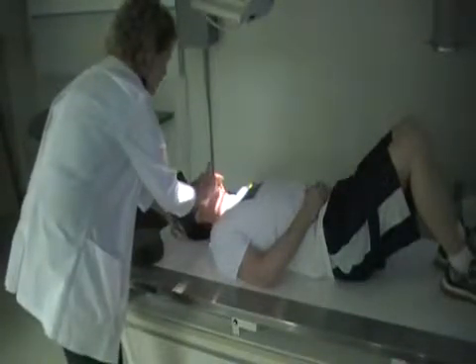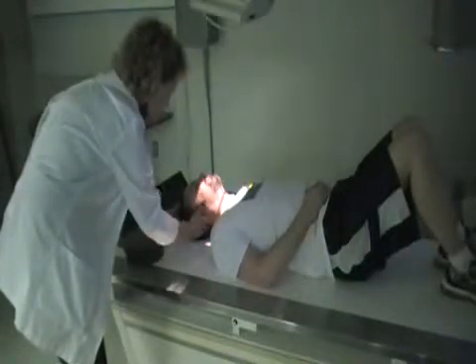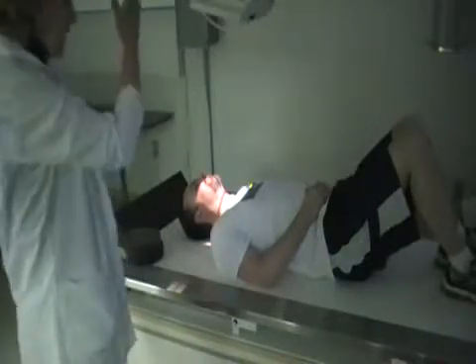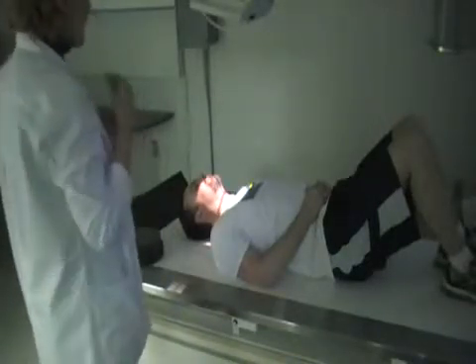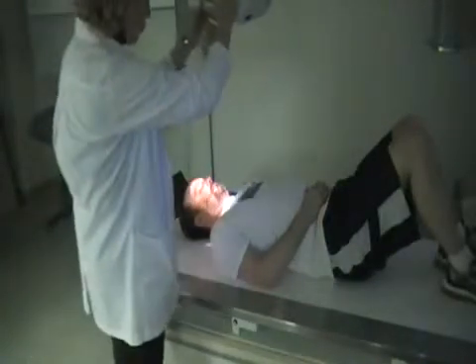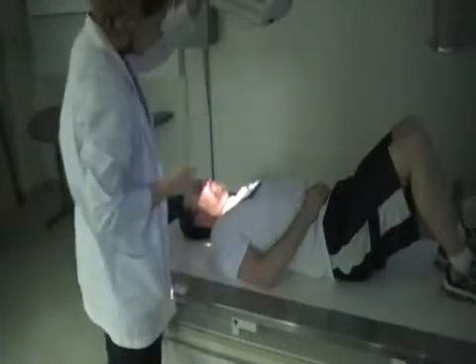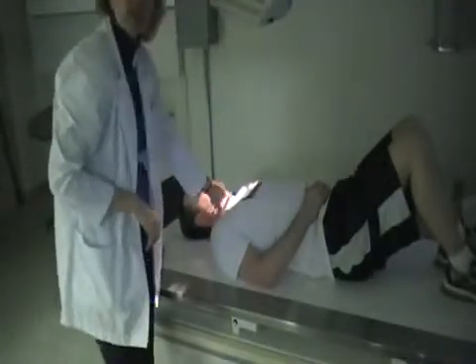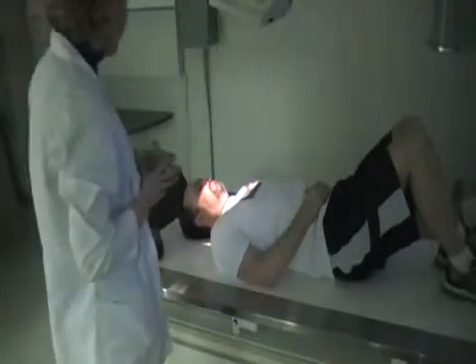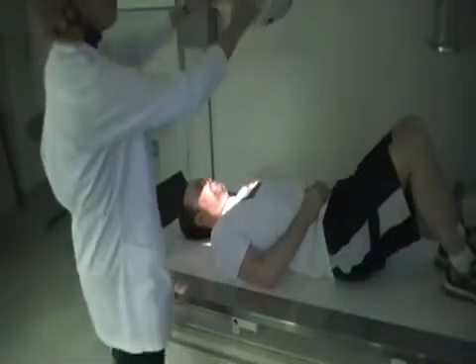You can bring the chin up just a little. Usually if the chin is at a position where it is in line with this mastoid tip, that's a nice position, throwing the head back. Now, if it is a trauma patient, if they cannot extend that head, what you're going to do is just put a little bit more angle on the tube, and then find the thyroid cartilage and center at that area. Because not always is your patient going to be able to do the complete extension of the head if they are injured. Okay, so that is our AP axial.